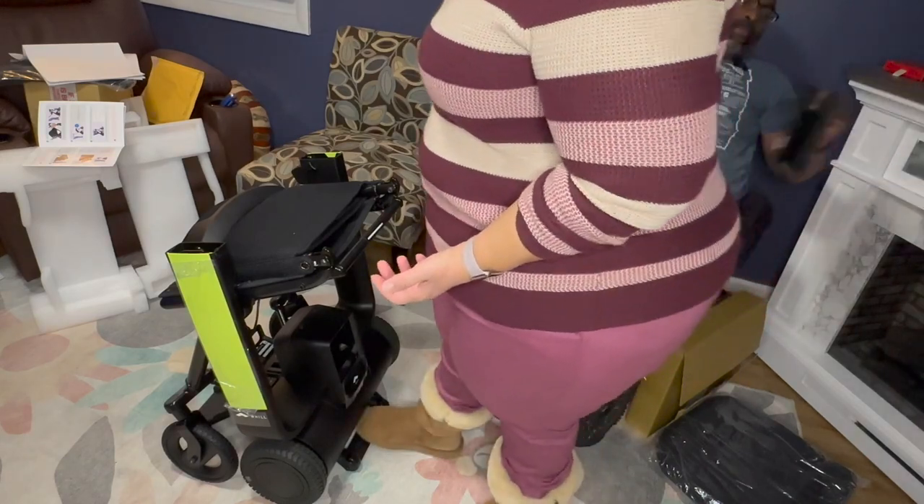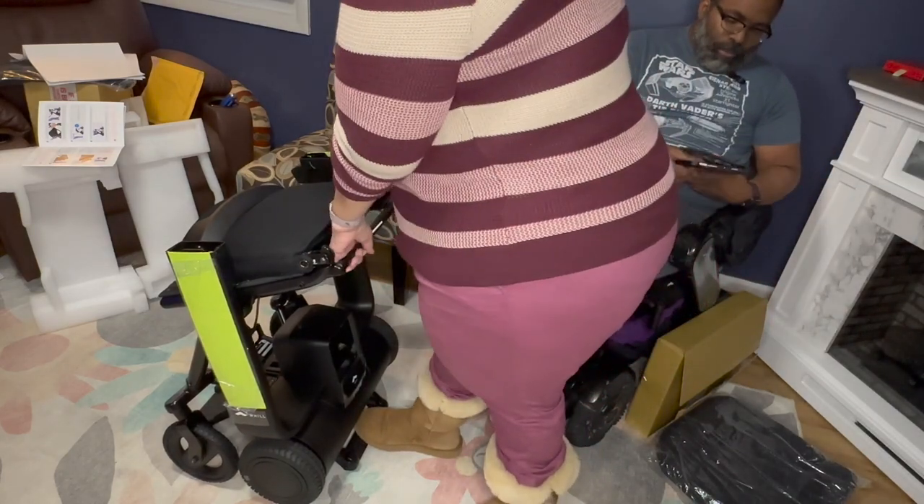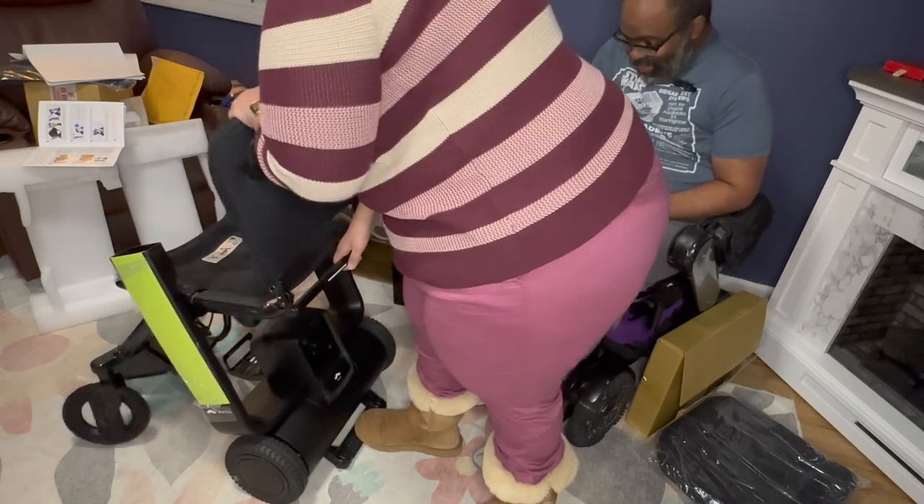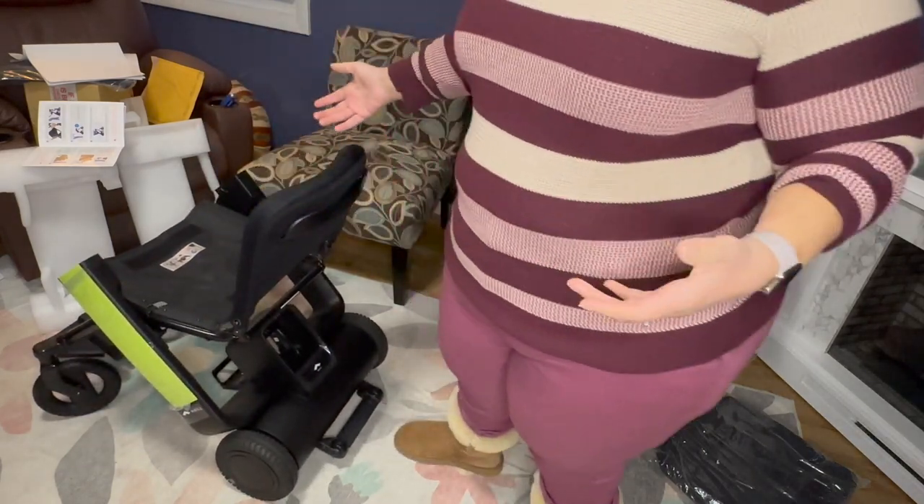So once I flip this up, then I push on this foot pedal down here, lift on this, and then there's a button over here. I slide that and then that — keep going forward. Ta-da!